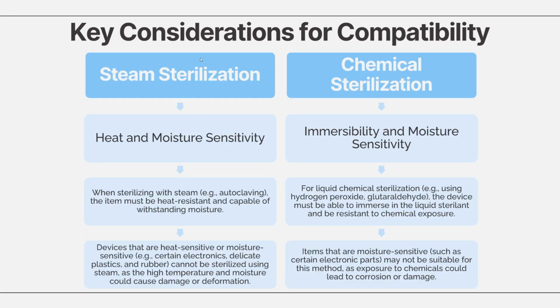So, here are some more key considerations for compatibility. It's important that the device can handle the process without damage. Steam sterilization needs devices that can tolerate high heat and moisture. Heat and moisture sensitive materials like plastics, rubber, or electronics can be damaged by steam.